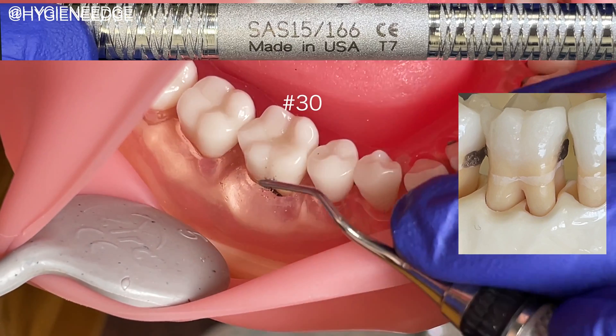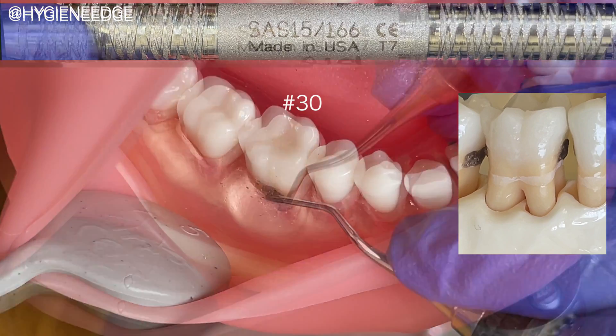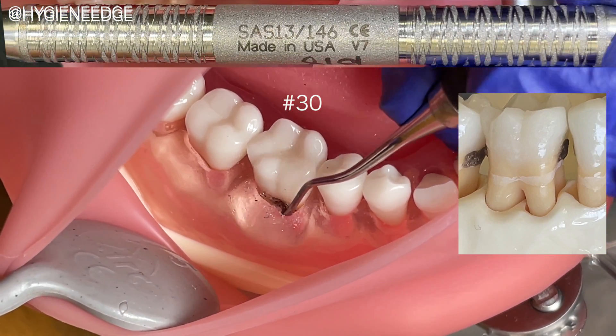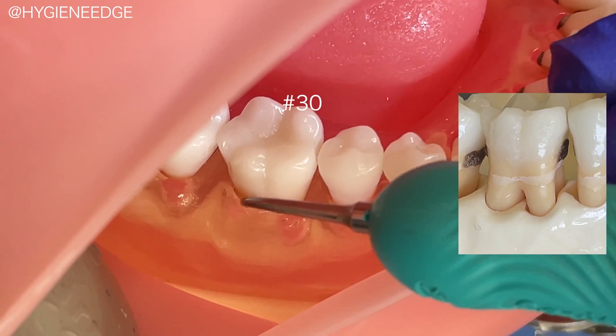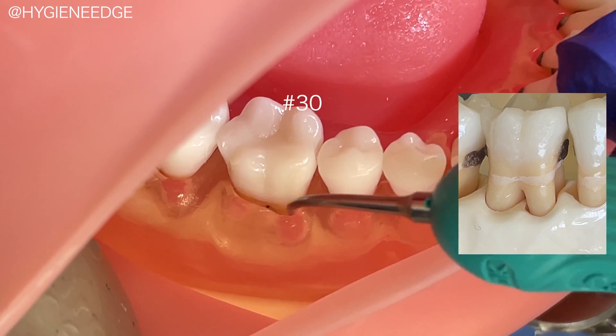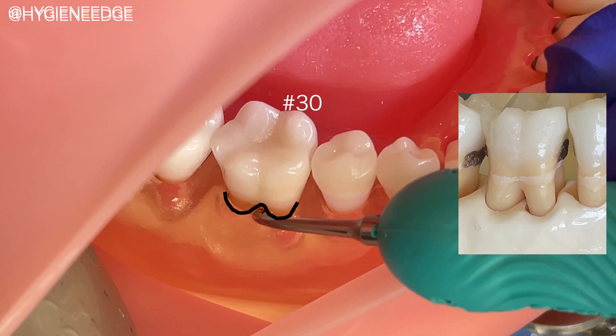It's always great to review your anatomy of teeth with furcations, like practicing on a model, to ensure that you know what you're feeling for. Using an exploratory stroke first before calculus removal strokes will help orient you. Once you feel comfortable with the anatomy, you can use an ultrasonic insert into the furcation with your channeling. I think of this furcation as being like a W shape, which helps me better adapt around the area.